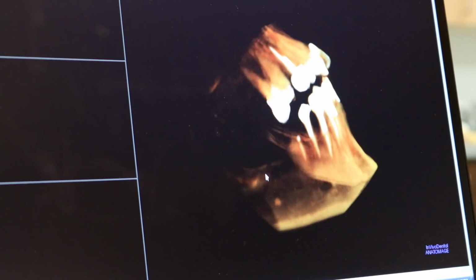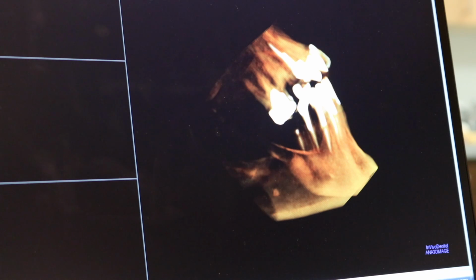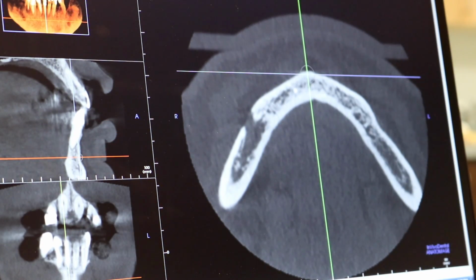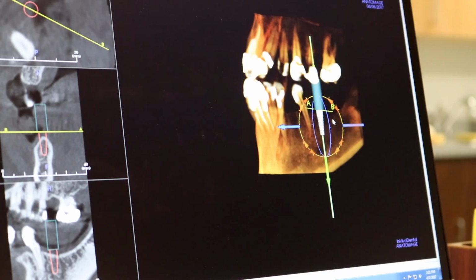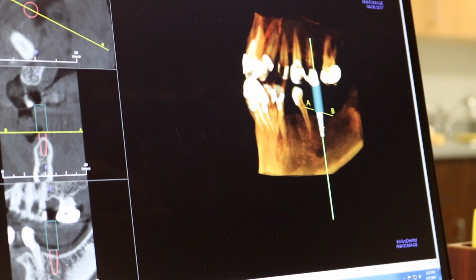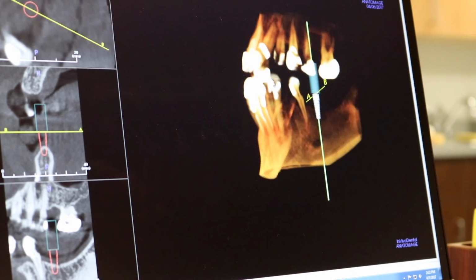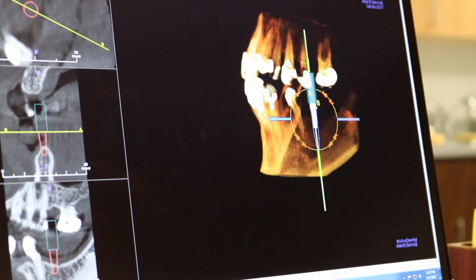One of the nice things that this does for us is we can virtually place a dental implant, and it takes the guesswork out of the procedure, where we used to have a lot of guessing. So what we're doing here is we're virtually placing a dental implant. I can move it around in different directions, up and down. I can rotate the jaw around in 3 dimensions. I can experiment with different sizes of implants, width, diameter, and length of implants.